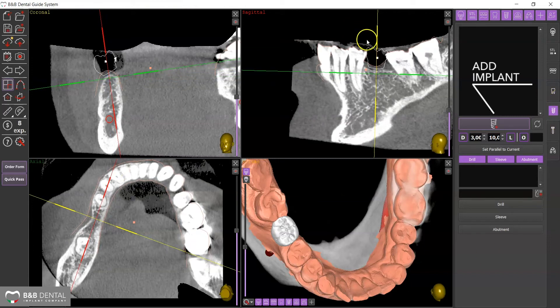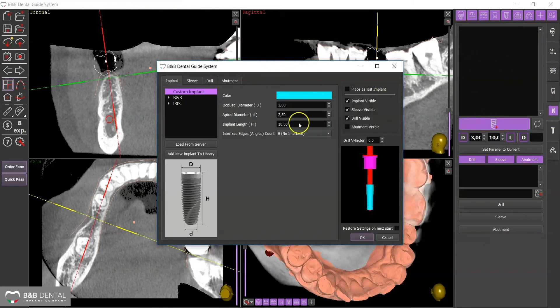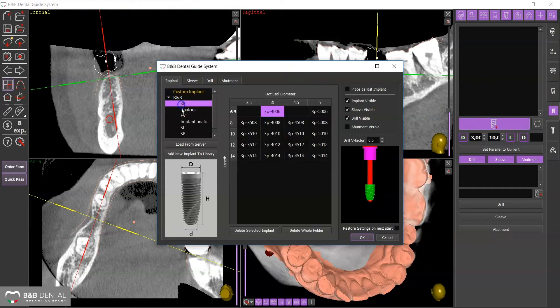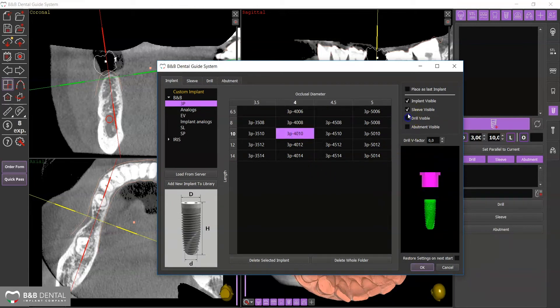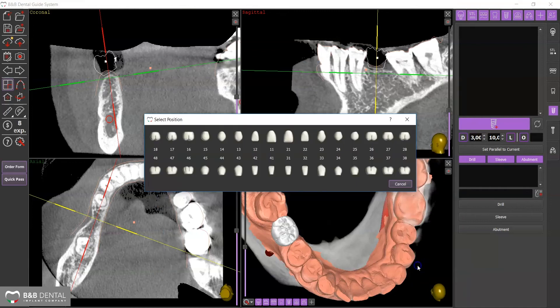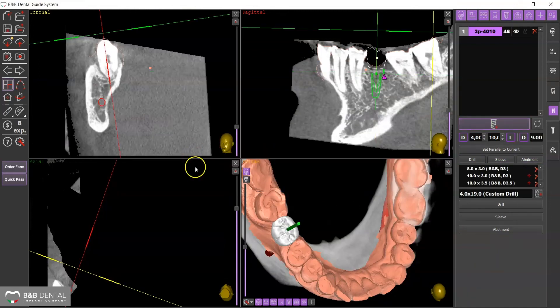Select the Add Implant icon. Select the line and the measurements of the implant to be inserted from the corresponding window, and select which elements — drill, sleeves, and implant — should be displayed. Confirm the level and select the position of the implant from the second window.